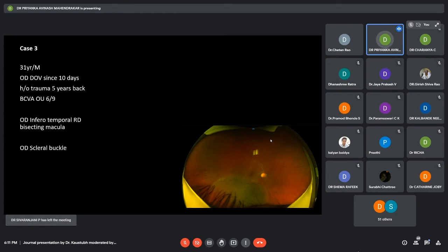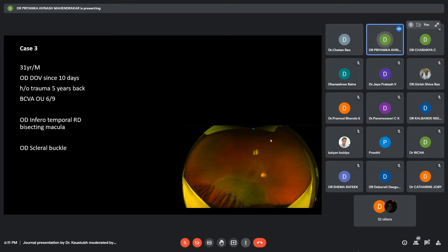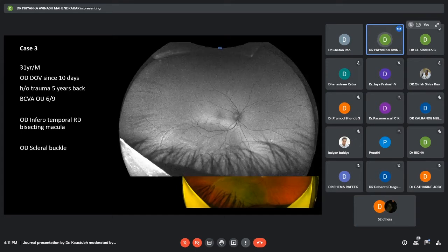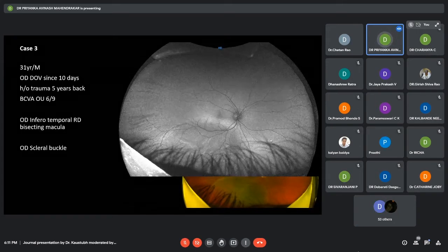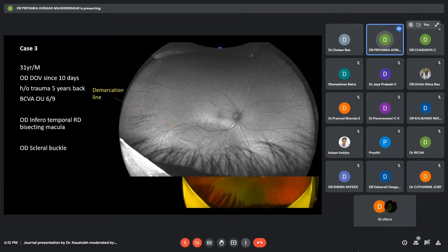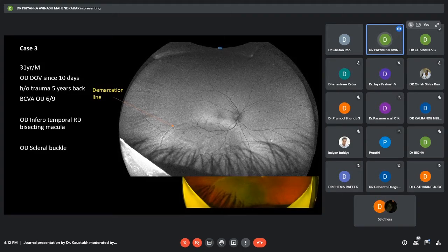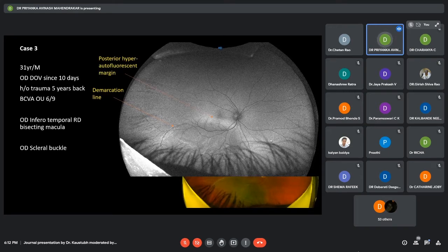The third case, we have a 31-year-old male with diminution of vision in the right eye, which he noticed 10 days back. He had a history of trauma 5 years back with a best corrected visual acuity of 6/9. We can see he has a right inferior temporal retinal detachment bisecting the macula. The autofluorescence imaging again confirmed the same finding. He again had a demarcation line, which suggested that it was a chronic retinal detachment. Also, he had a posterior hyper-autofluorescent margin.